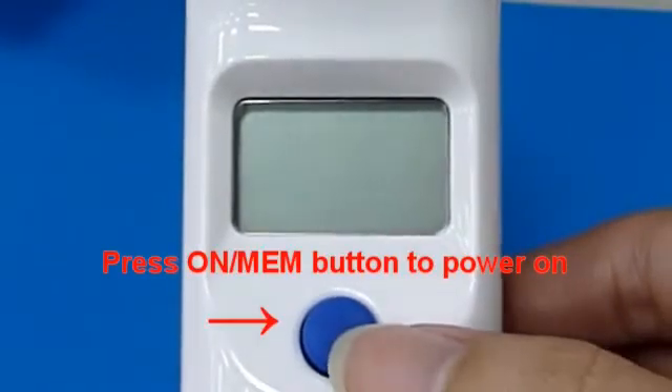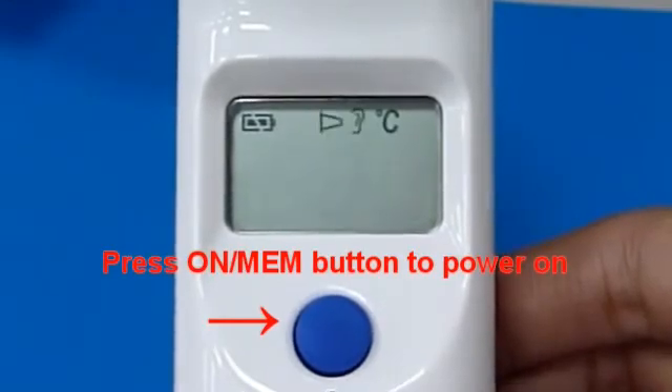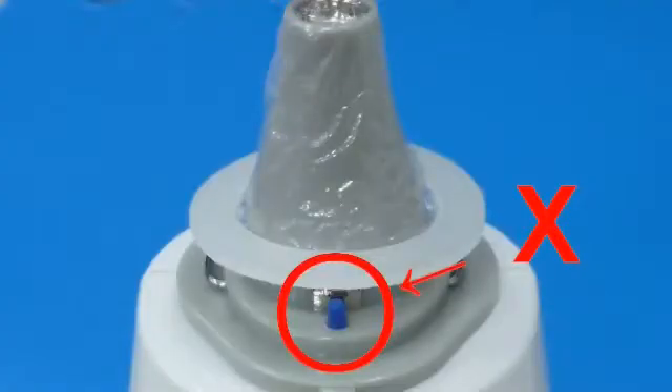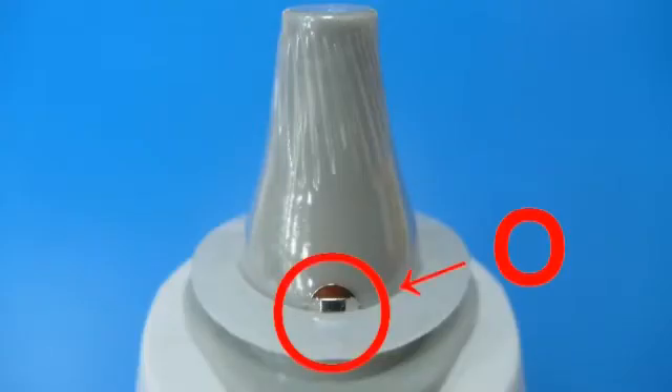Press the memory button to power on. If you see the probe cover icon flashing on the LCD screen, that means the probe cover did not connect firmly. Check the setting of the probe cover again and make sure the probe cover has been connected with the probe cover detector firmly.